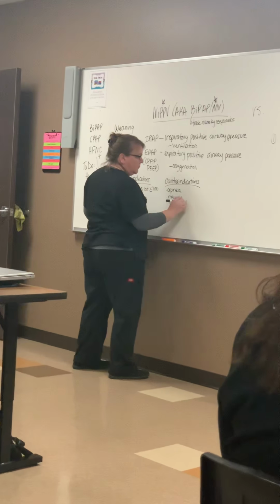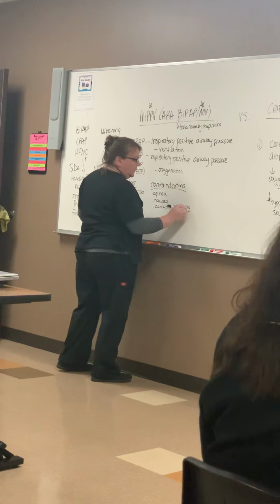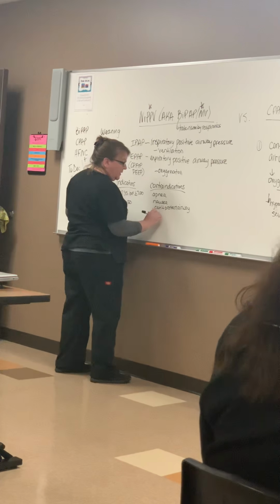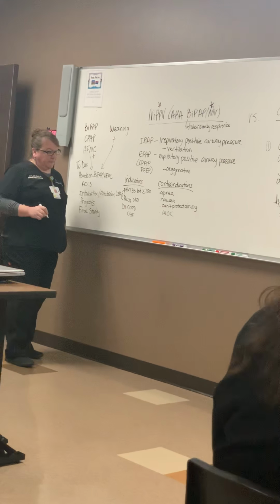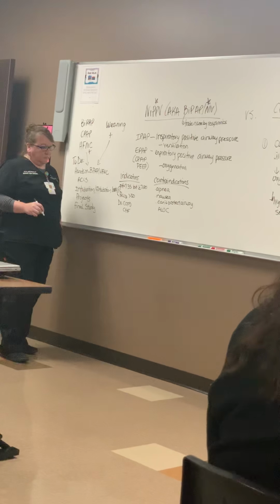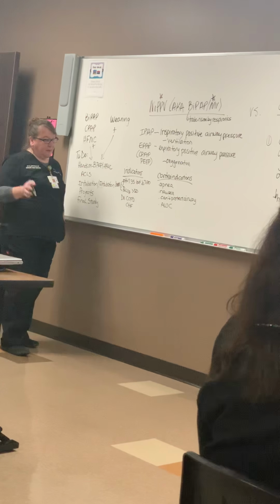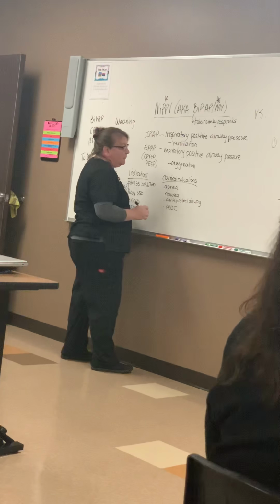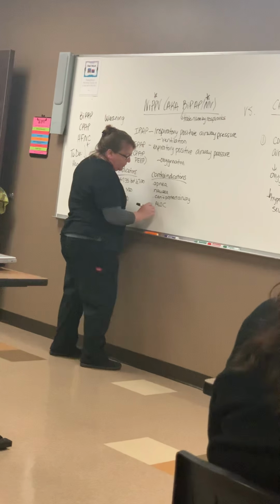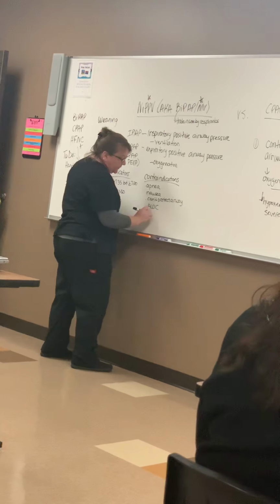Unrestrained. ALOC, altered level of consciousness. Get used to seeing that. Hemodynamically unstable. That one's kind of iffy. Sometimes the patient needs it to become hemodynamically stable, but you just have to watch. Facial trauma, for sure.